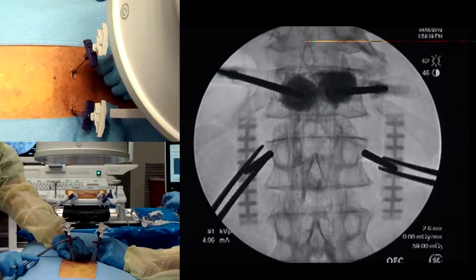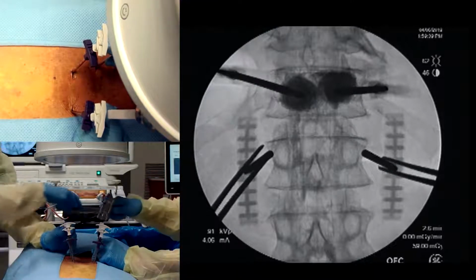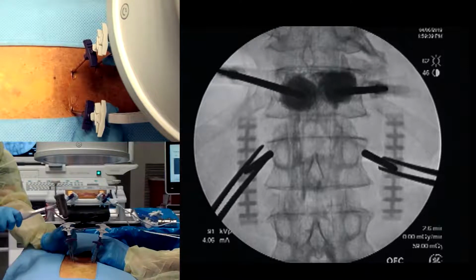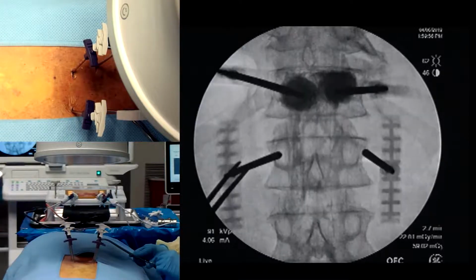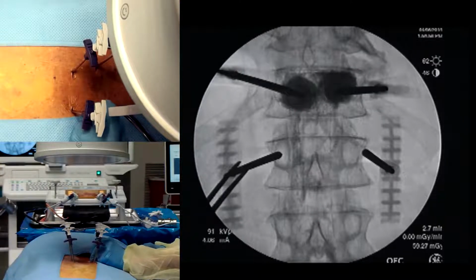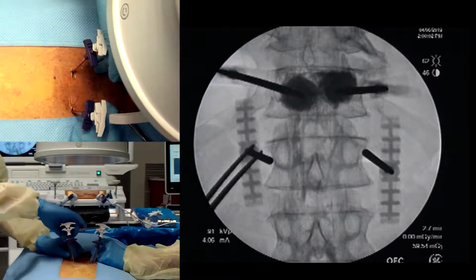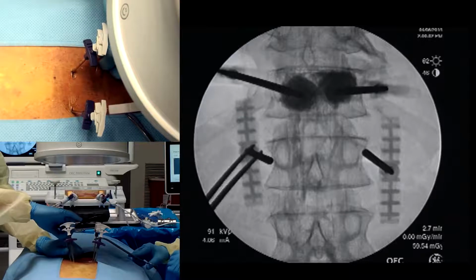So why don't we both start it, mallets please, and then aim caudal a little bit. Yeah. Yep, I slid off, so you aim medial. I think you're sliding off a little bit, huh? Yeah. So you might want to picture that. You might want to take a slightly more medial.